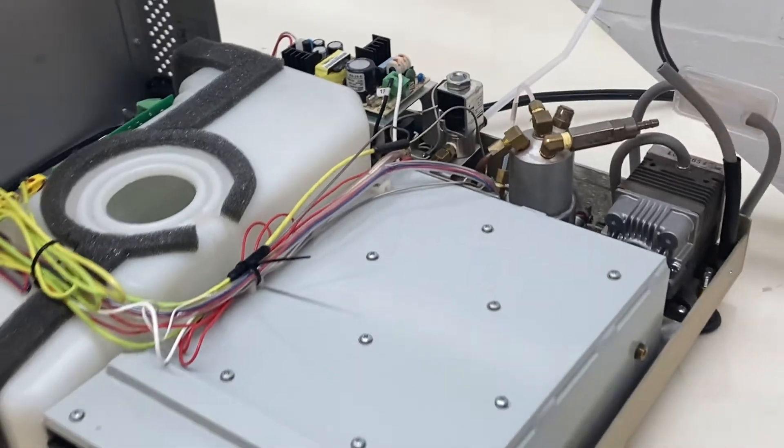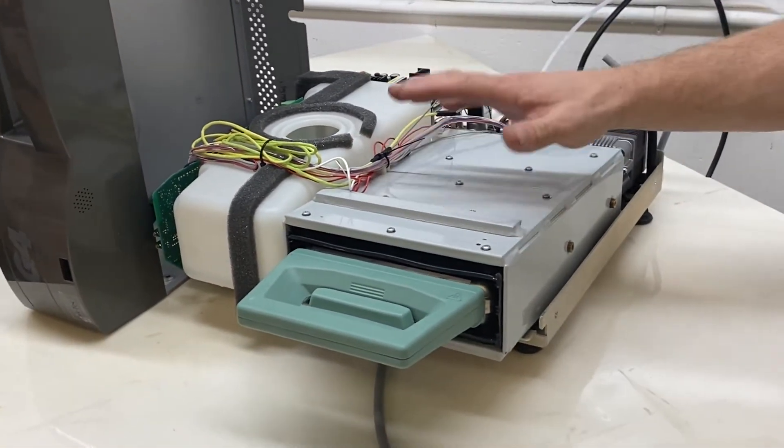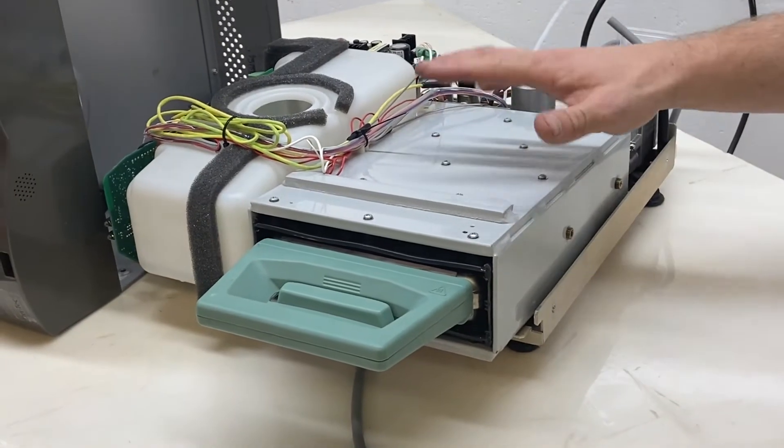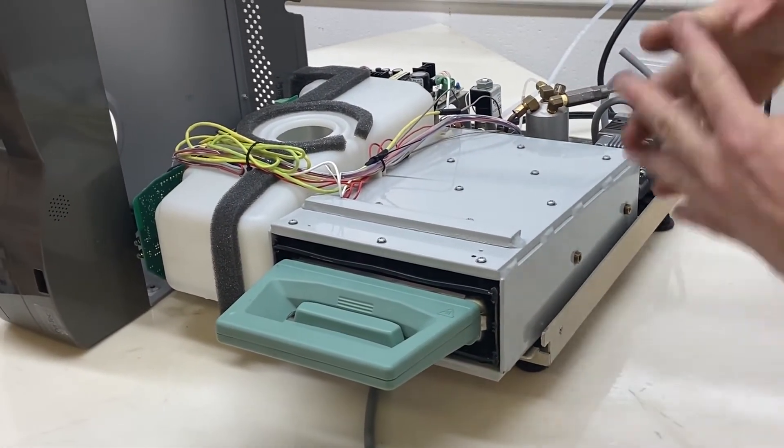In my experience, when that kind of stuff happens, it's probably that your cassette is overpacked. You've got so much stuff in there that the three thermocouplers just can't agree on a temperature.